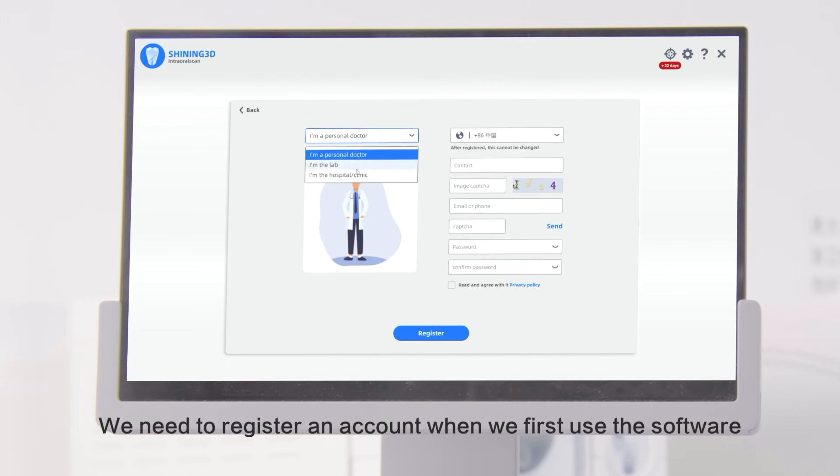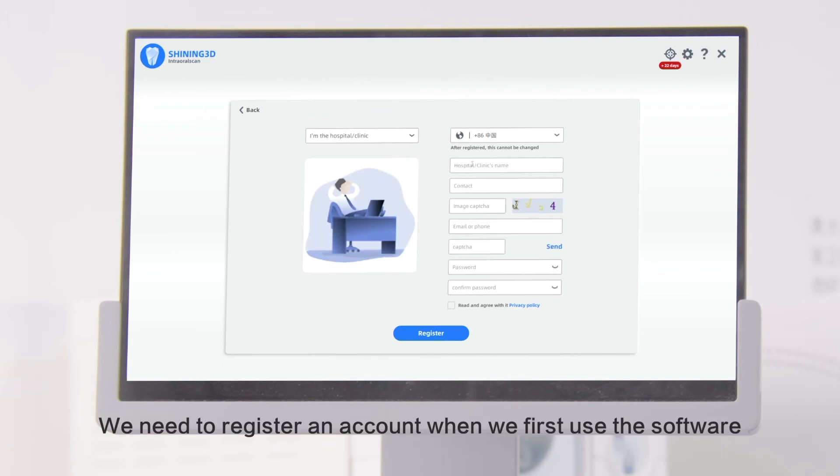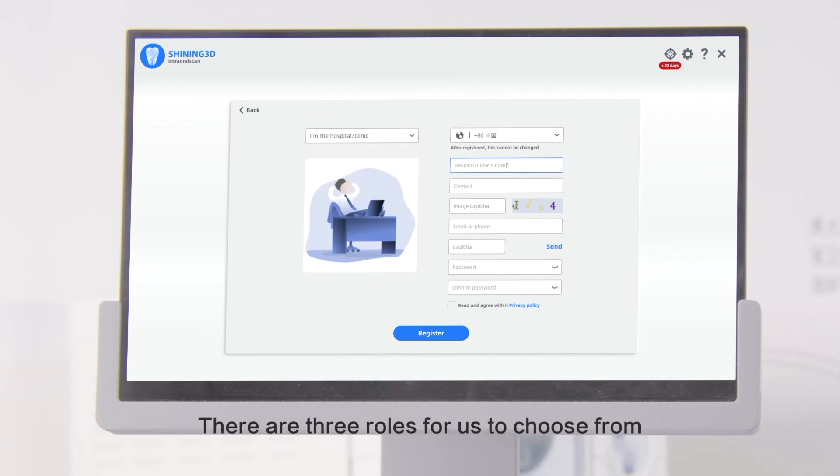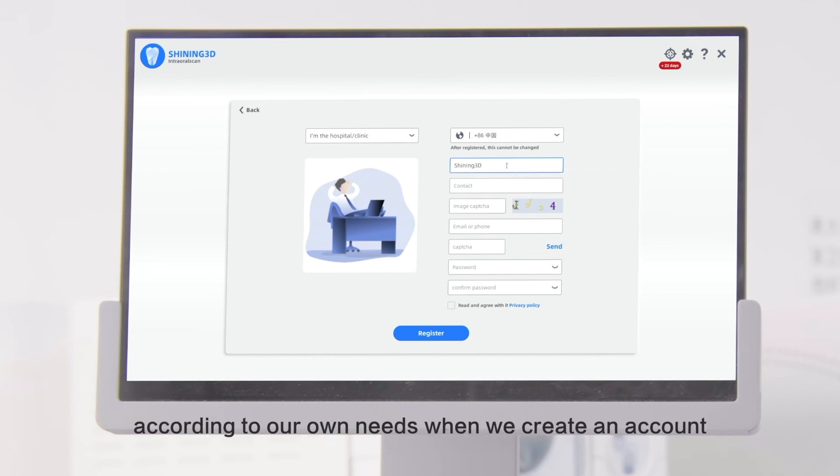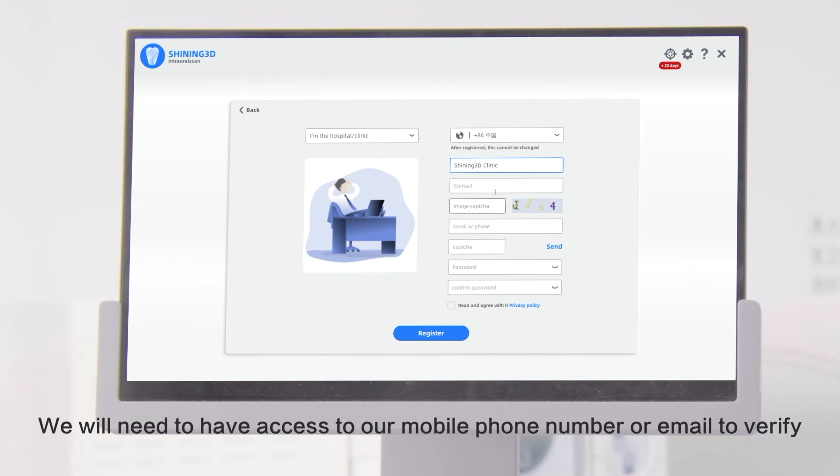We need to register an account when we first use the software. There are three roles to choose from according to our own needs when we create an account. We will need to have access to our mobile phone number or email to verify.